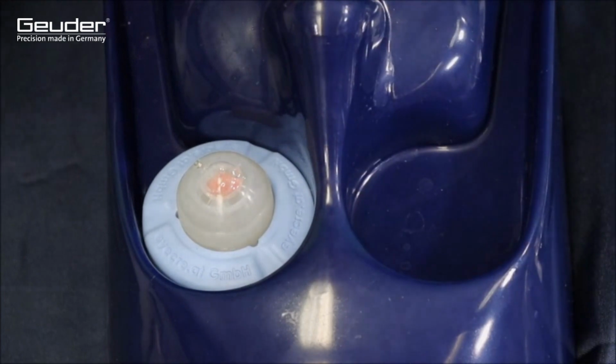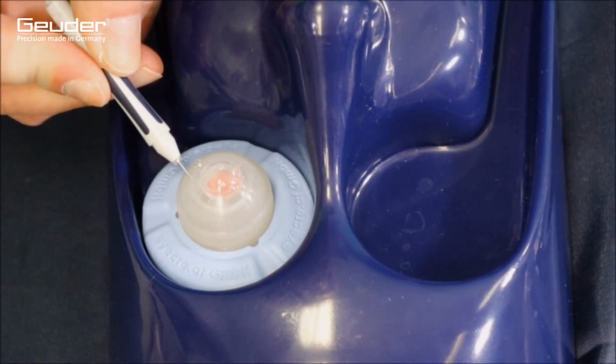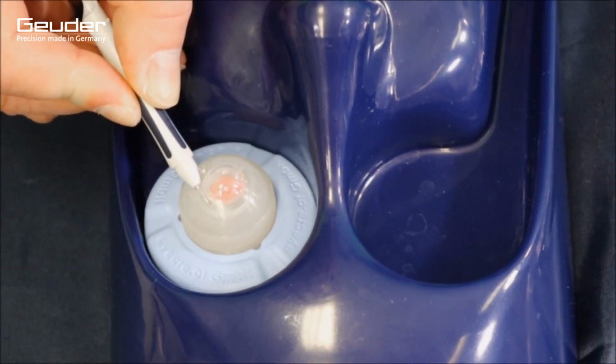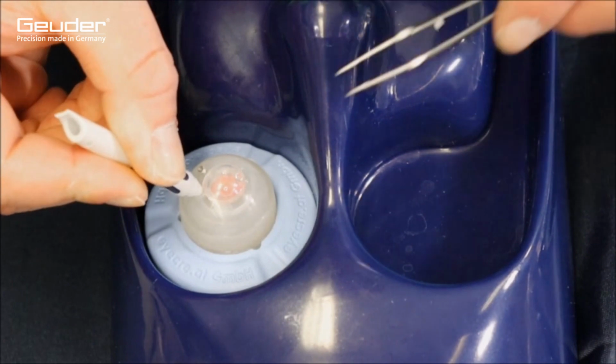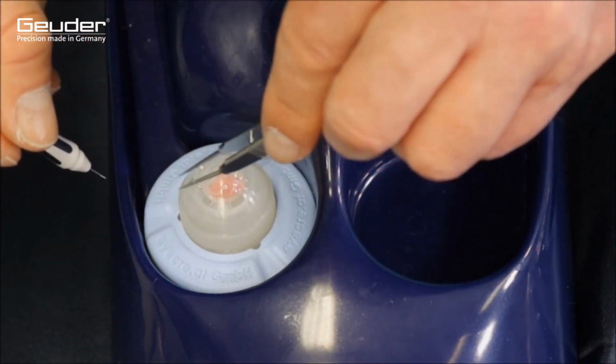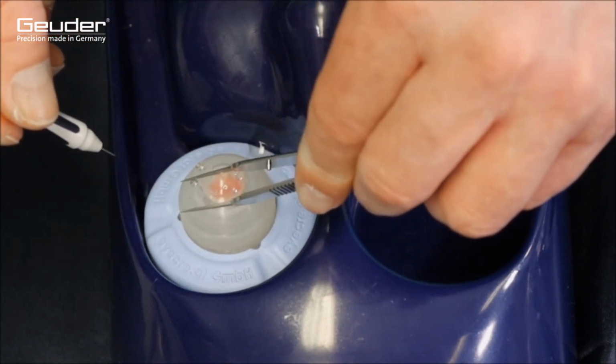This technique of insertion is intended to ensure that the trocar lances follow the lamellar structure of the sclera and result in only a small wound channel with correspondingly little trauma. The created sclerotomy should be self-sealing after removal of the trocar and thus make suturing over the sclerotomy superfluous in most cases.